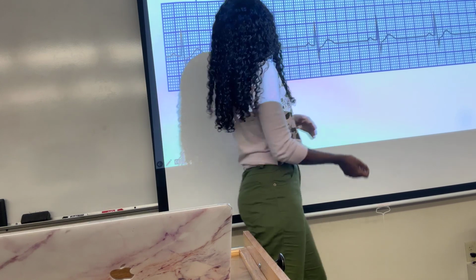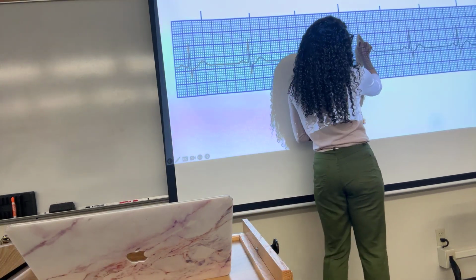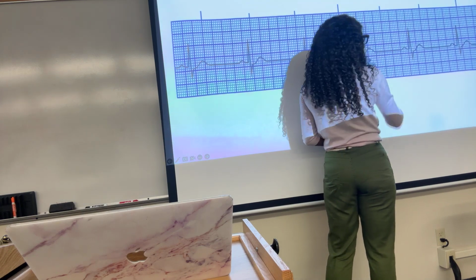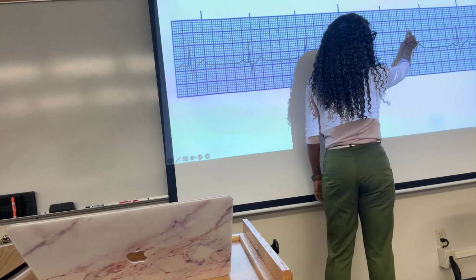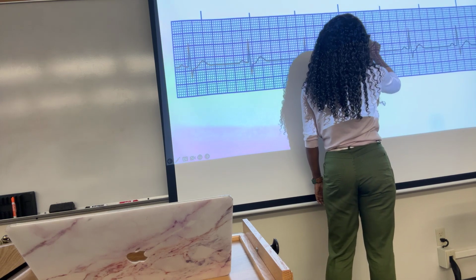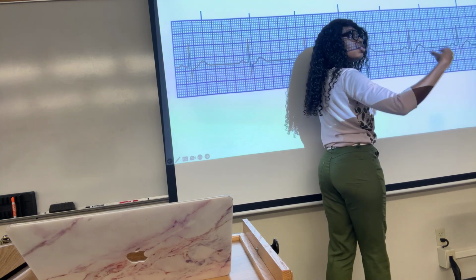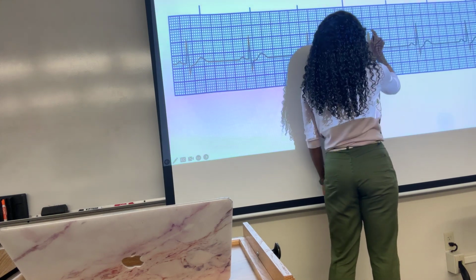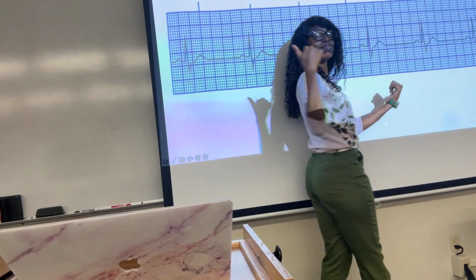Okay. So we would say, from here to here, we would count 5, 10, 15, 20, 25, 30. Okay, 30, 1500 divided by 30. And then it's plus 1, right? 31. So 5, 10, 15, 20, 25, 30, 31, 1500 divided by 31. Or I could say 300 divided by 1, 2, 3, 4, 5, 6. That'll also give it to me. Got it? Yes. Because it's regular.